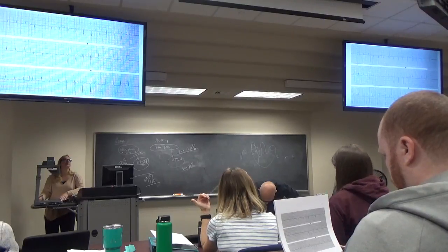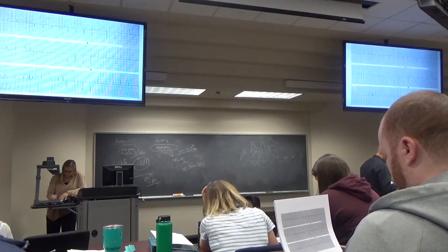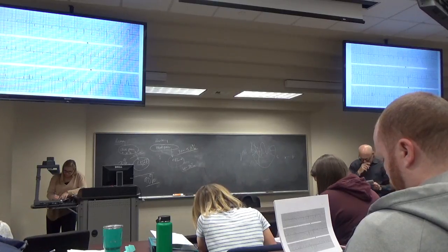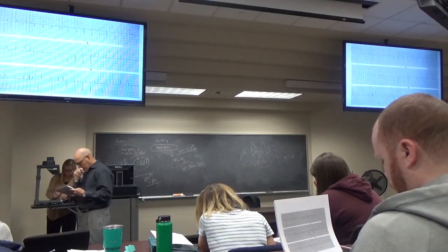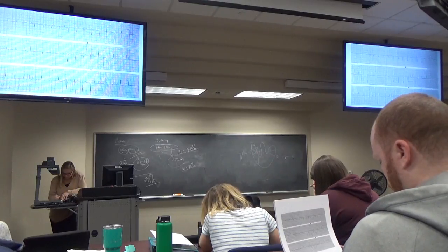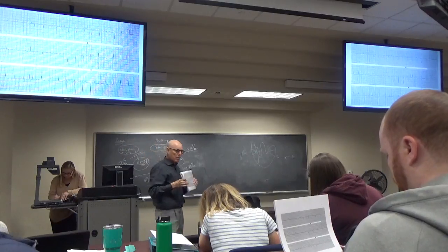Kristen? Okay, I got a regular sinus rhythm, heart rate of 90, PR of 0.16, QRS of 0.08, QT of 0.32, the axis is normal at plus 70. We saw that leads 2, 3, and aVF had depressed T waves, so we called it ischemia of the inferior wall.